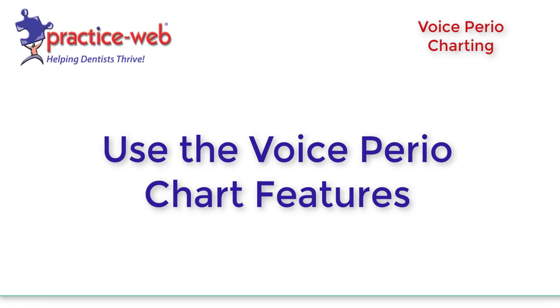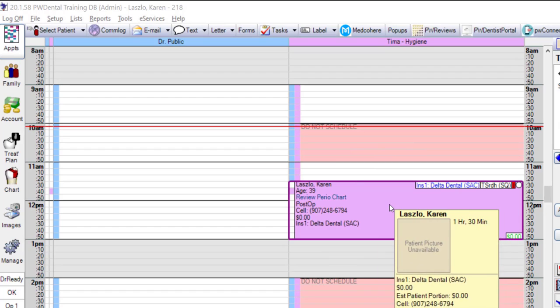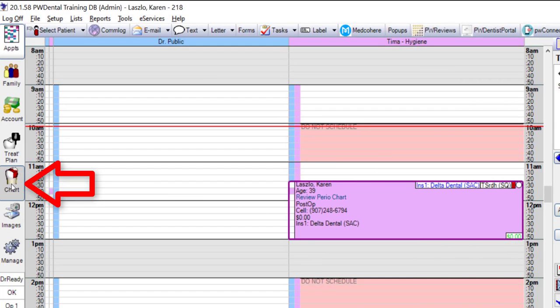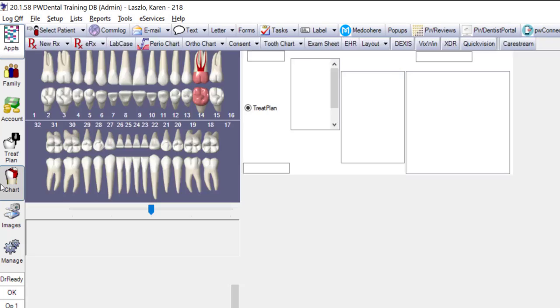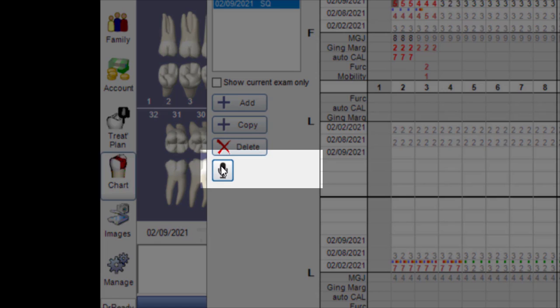After your computer and PracticeWeb is set up with a headset, access your patient's chart. Go to Select Patient, then Chart Module, and click on the Perio Chart button on the toolbar. Once that is open, click on the mic button in the perio chart window.